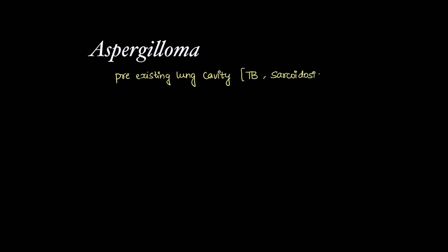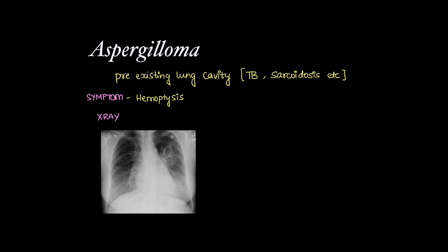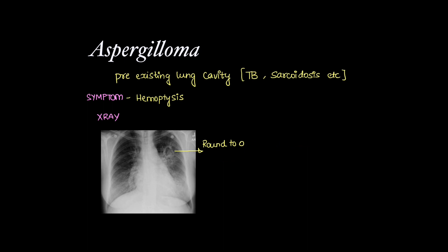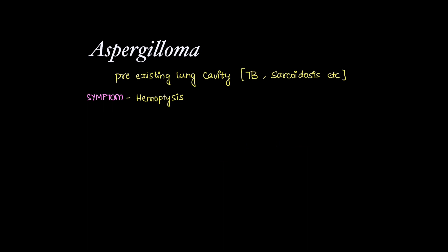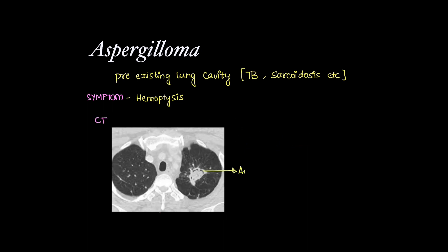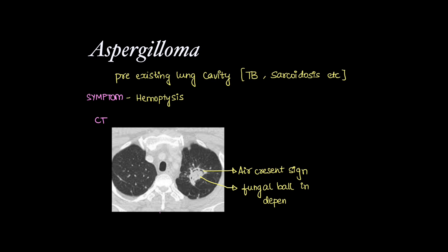Aspergilloma occurs in a pre-existing lung cavity formed due to TB or sarcoidosis. The symptom is hemoptysis. On X-ray, we can see a round to oval soft tissue with air crescent sign, classically known as the Monod sign. On CT, we can see the air crescent sign with a fungal ball that changes its position between supine and prone positions of the patient.